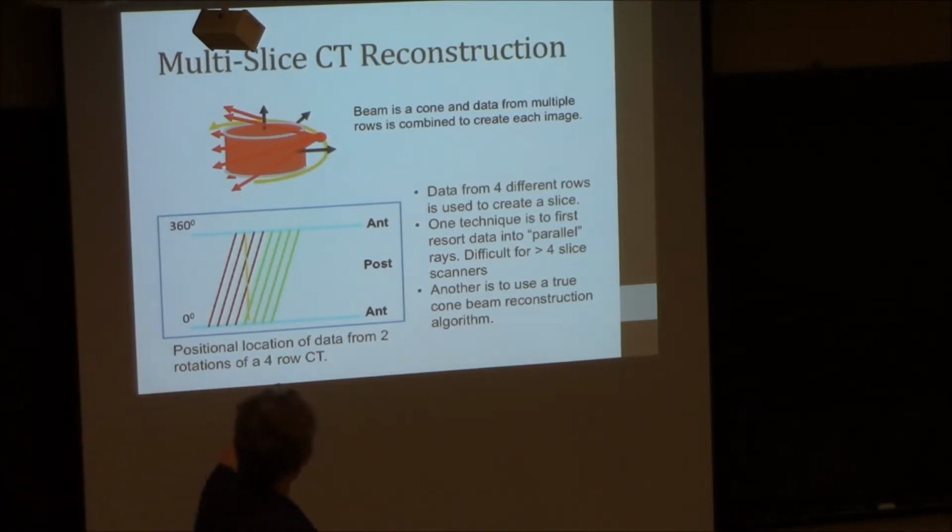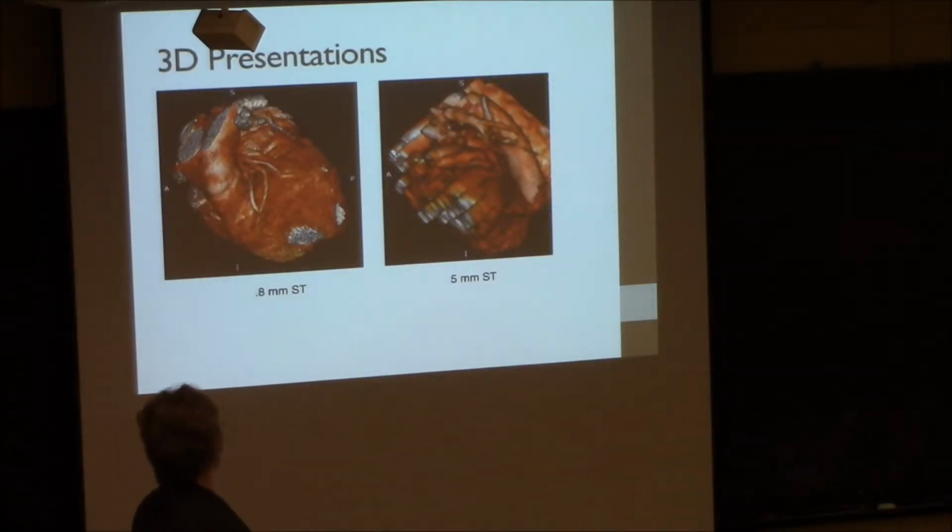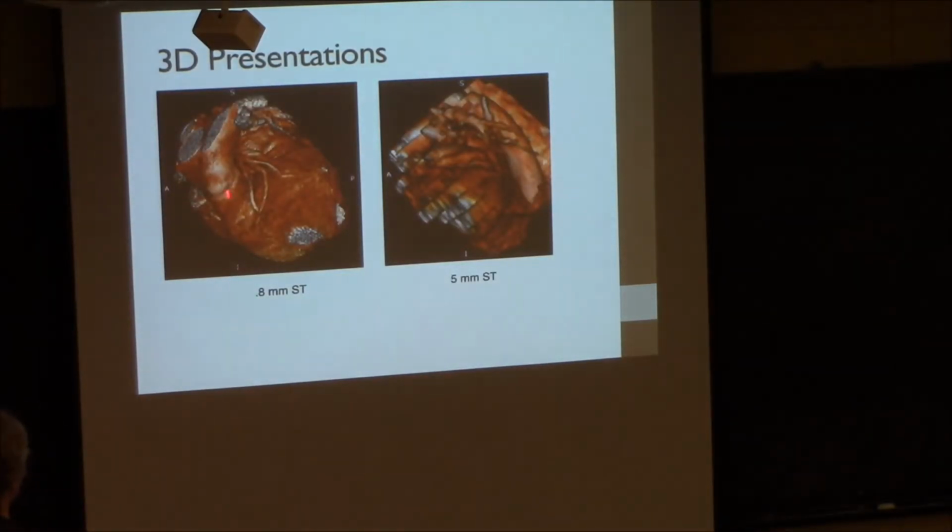So between this kind of imaging, spiral imaging, and the speed that you can get, you can get these beautiful 3D images of coronary arteries and look for plaque and blockages and those sorts of things that they do nowadays, instead of the old way, which was a 5 millimeter slice, another 5, and then trying to put them together and make some sense out of them. So speed has become a big thing, as we can image a lot faster than we used to.